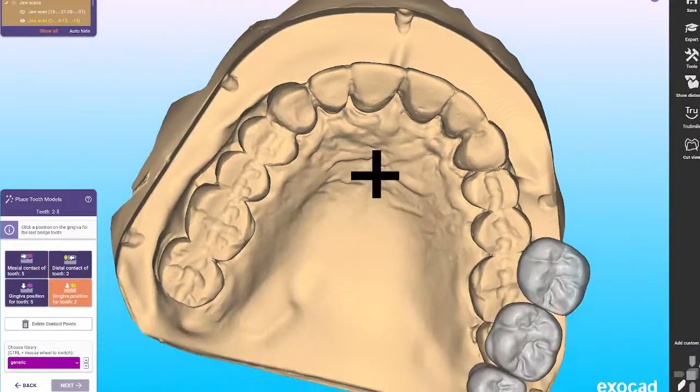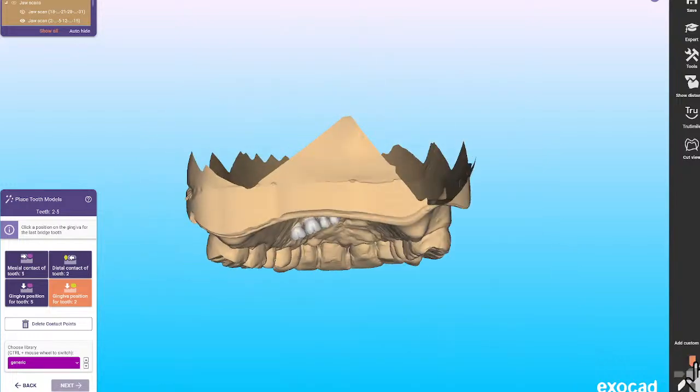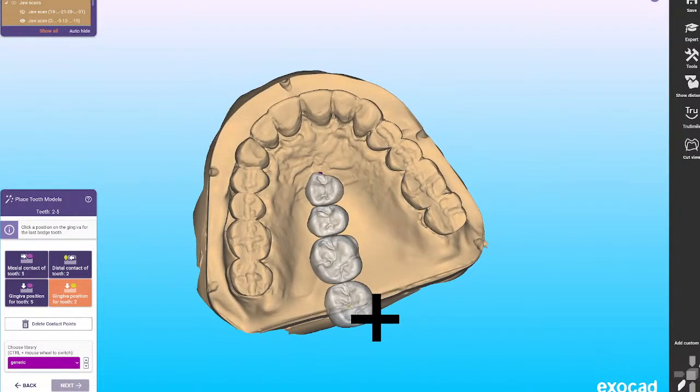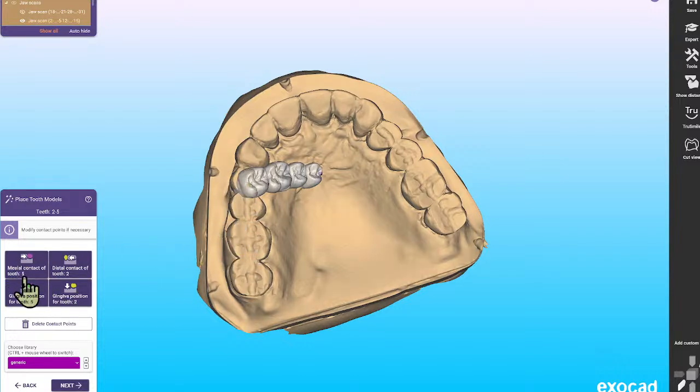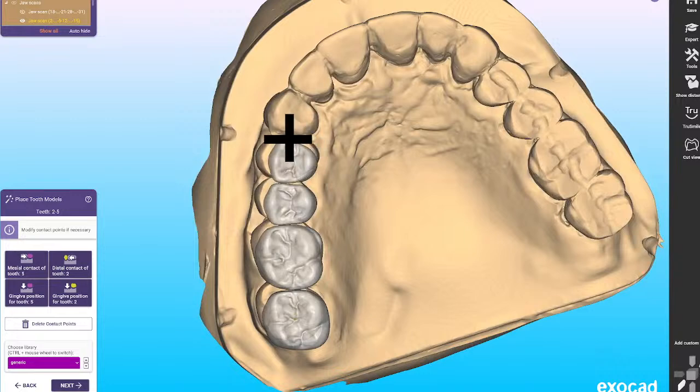Okay, so I'm going to put this way, and let's get this, hold on. Turn this way, okay. So now it wants me to start from the mesial contact of the tooth, so we start over here. Let's do that, and bring that here. Okay, I am going to change my mouse, it's slightly too big. So let's change my mouse setting. Mouse pointer. A little too big for this, kind of blocking the view. So let's see the pointer, mouse window.